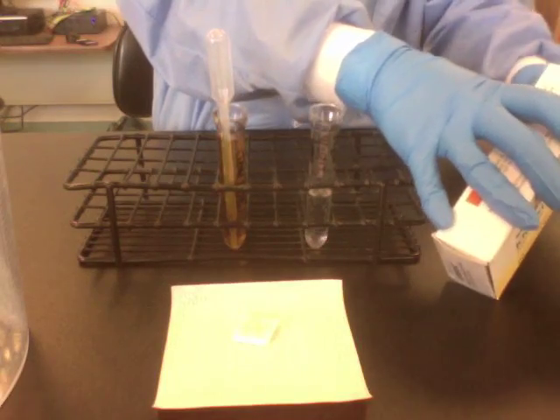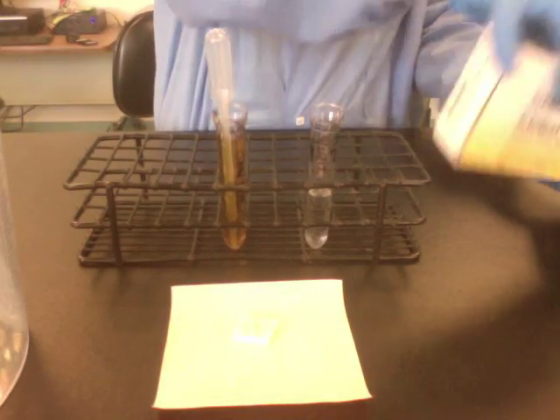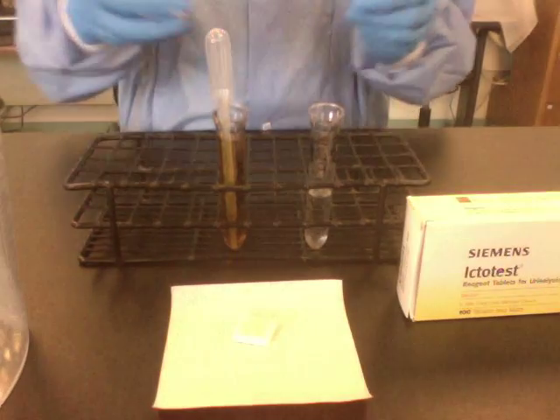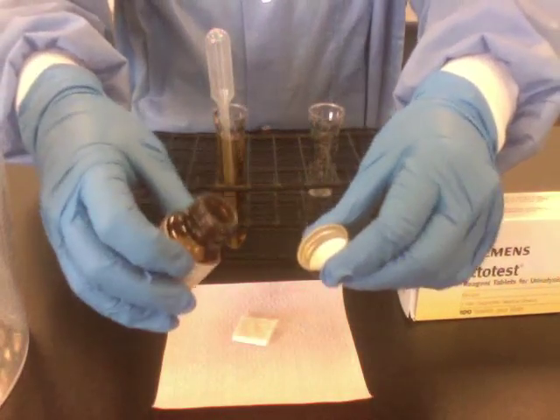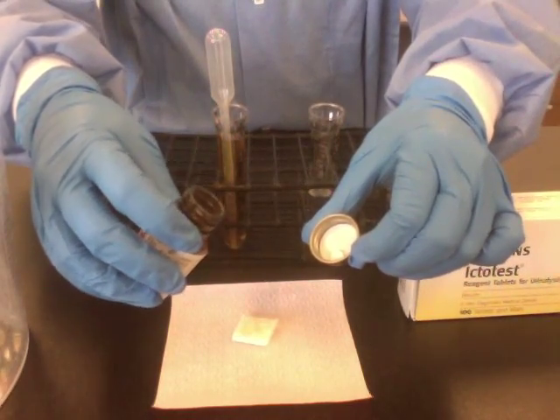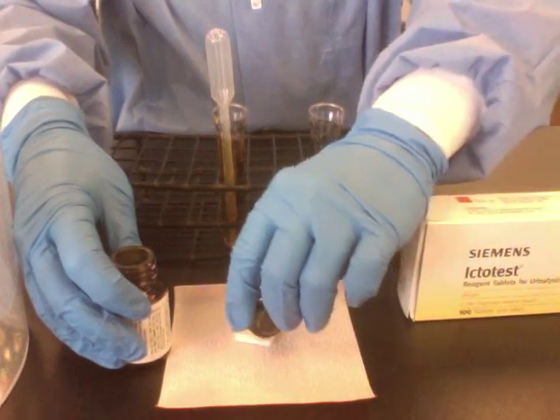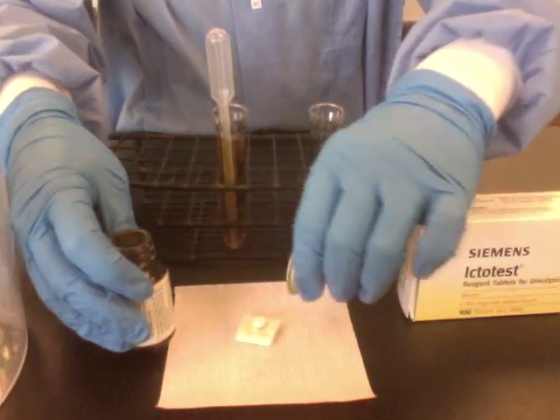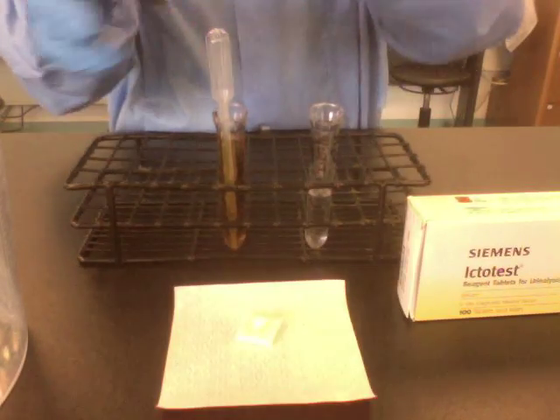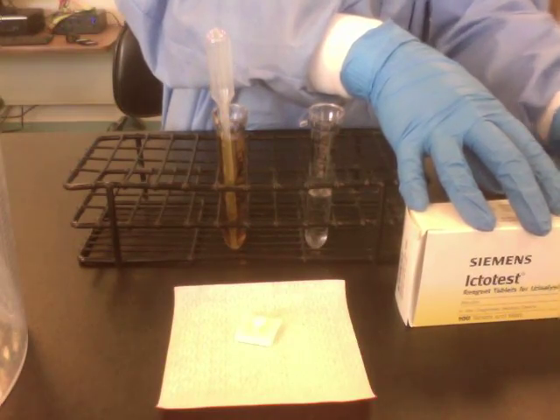Then you're going to add the Ictotest tablet. I'm going to shake the tablet off into the lid first, not onto my gloves — you should not touch these tablets. And then I'm going to gently, carefully place the tablet onto the pad. Replace the top of the vial there.